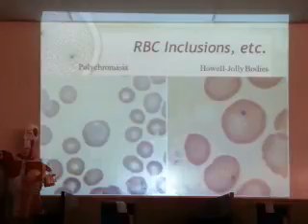Yeah? You'll have to look at it real closely. But it's purple because it's taking up the methylene blue a little bit more than the other red cells. And remember what methylene blue likes? Basically, things like RNA, ribosomes, stuff like that, right? So this particular red cell is a cell that just got out of the bone marrow. So it's still active in making hemoglobin. And hemoglobin is a protein, so it's got a lot of ribosomes, right?